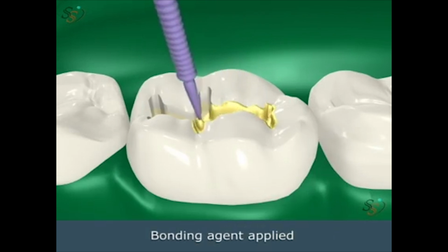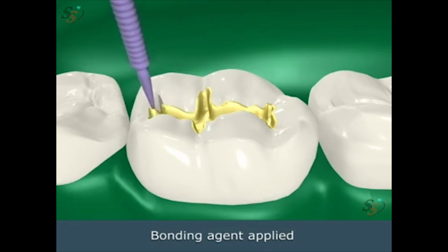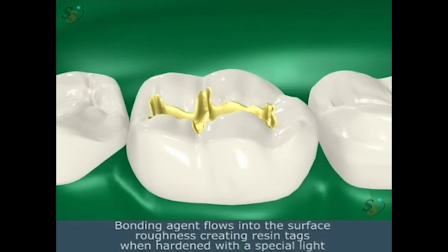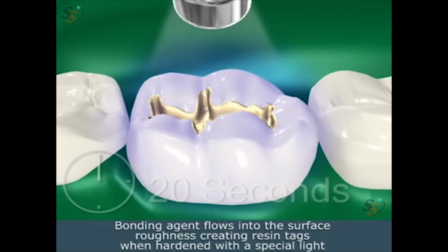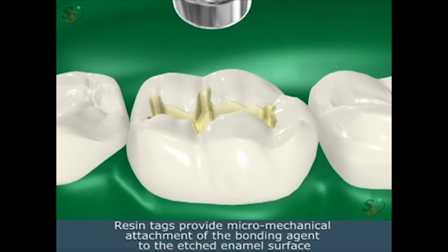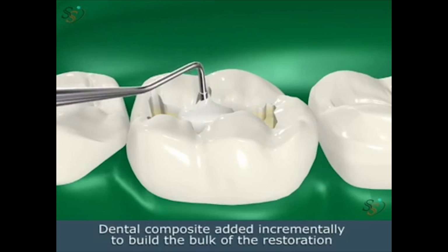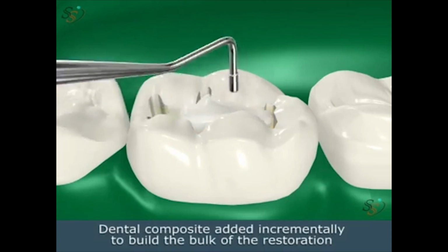The bonding agent is now applied. Bonding agent flows into the surface roughness, creating resin tags. When hardened with a special curing light, resin tags provide micromechanical attachment of the bonding agent to the etched enamel surface. Dental composite is then added incrementally to build the bulk of the restoration.